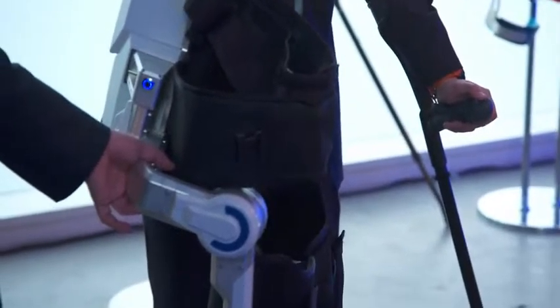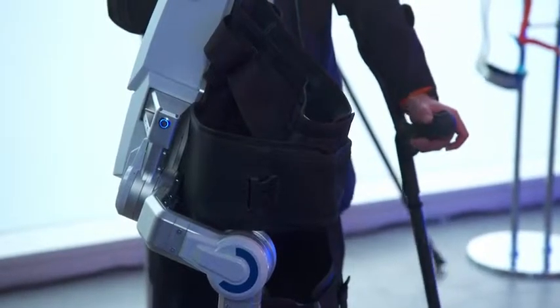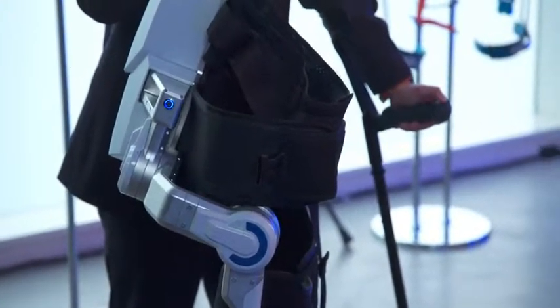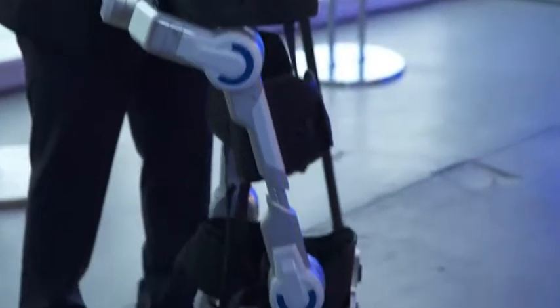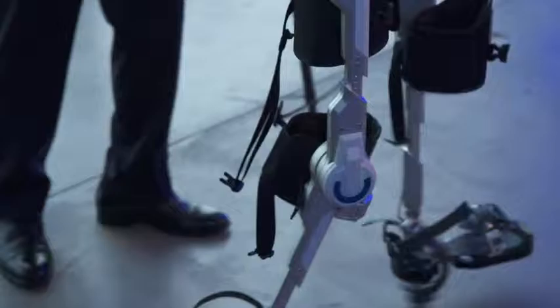The first step is to think about the patient in the robot. The patient waits with his left leg like this. And then if I push the button, the robot is forced to step like that.